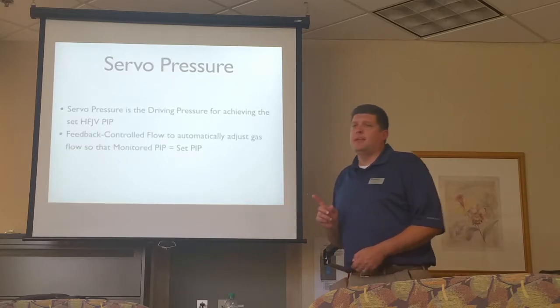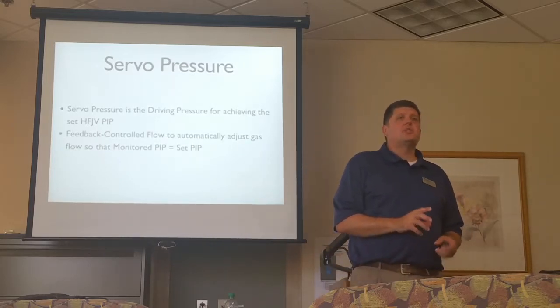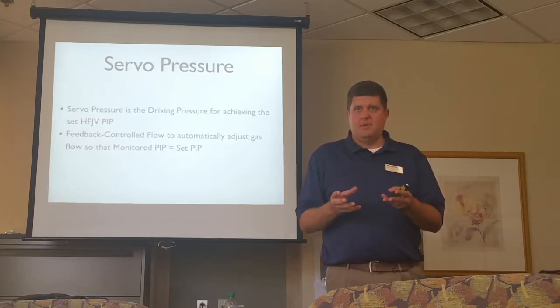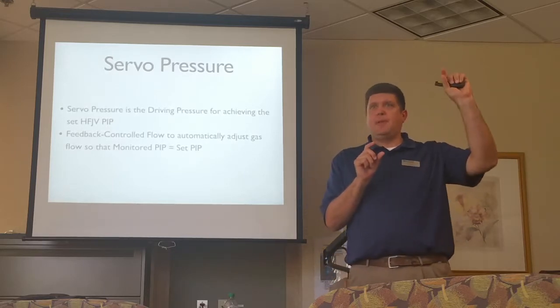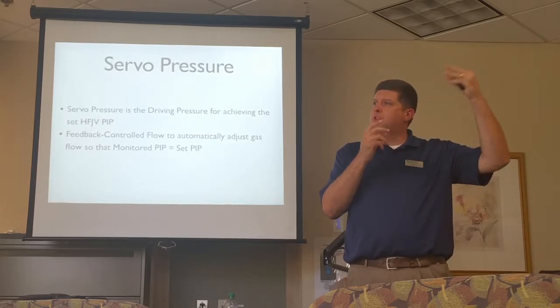It's a servo mechanism because it's feedback controlled. The jet looks at your set PIP, then it looks at the monitored PIP, and it will automatically adjust its flow to make sure the two are the same.